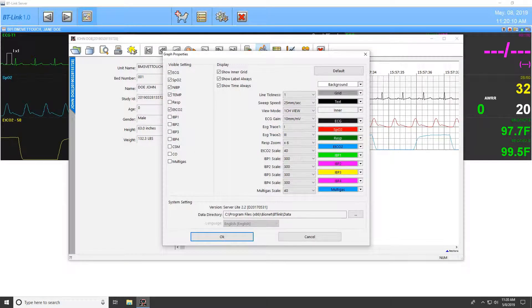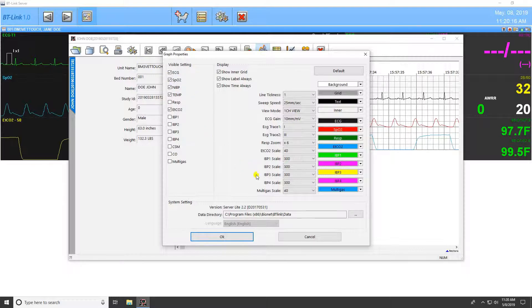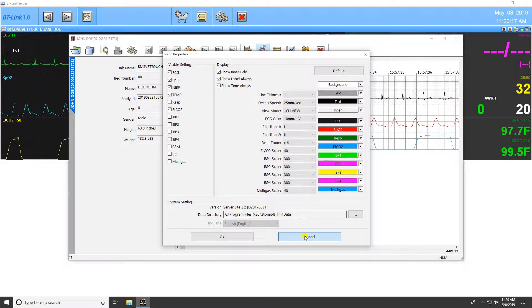The gear icon allows you to customize how you would like the study to look while reviewing it. You can choose which parameters are displayed, and what color and size those parameters should be displayed in.